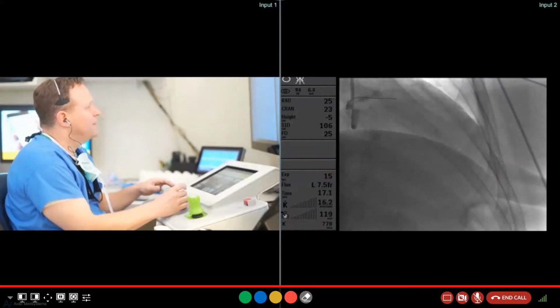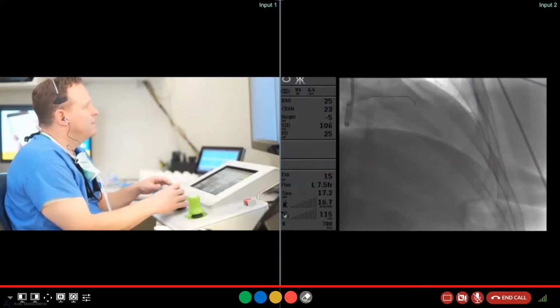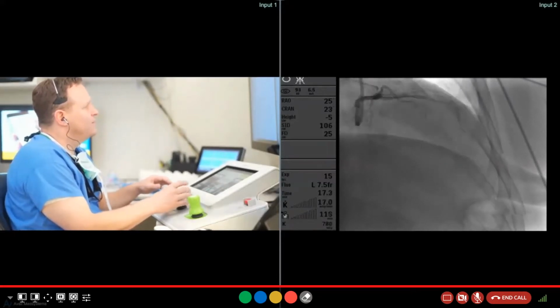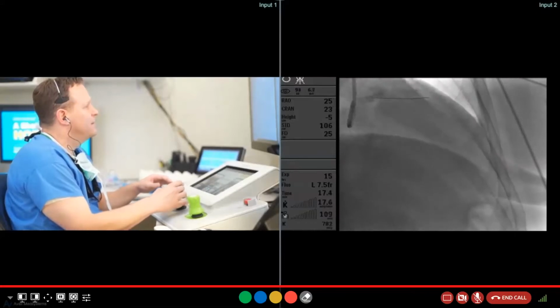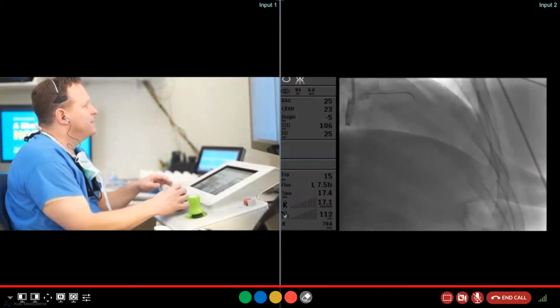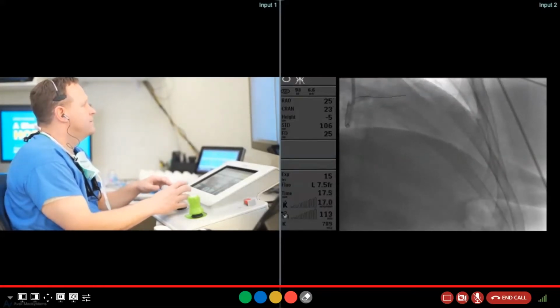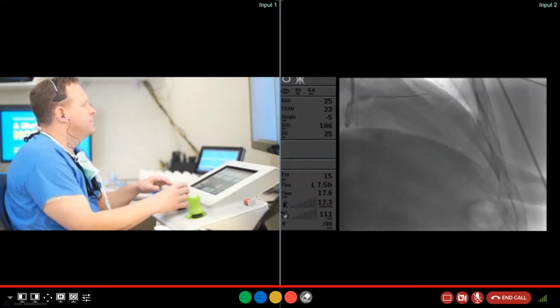And if you look at my hands here, I've got right to left rotation at really excellent control. Give a puff there, Sam. The only time I can't find a septal is when I'm doing a CTO, and I can find it every time otherwise with the LAD. Oh, let's back up again. I'm going to rotate a little bit. Puff that, Sam.